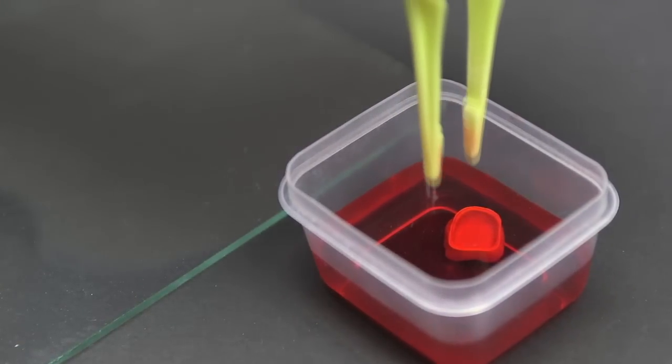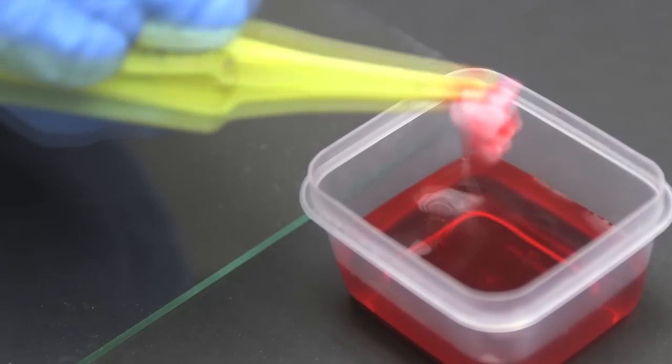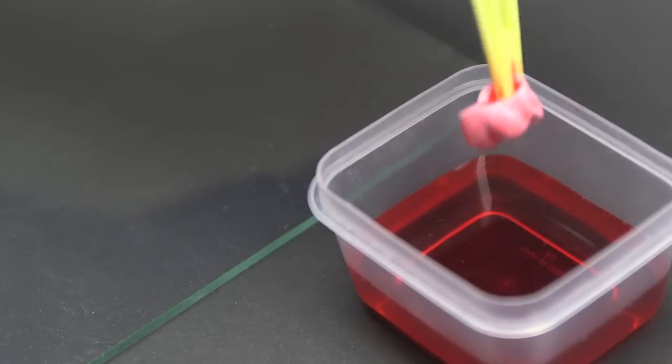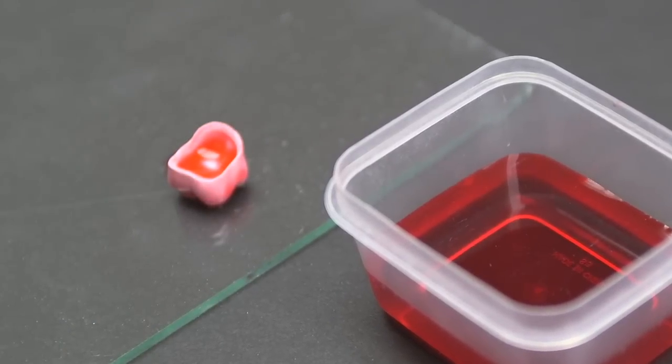After 15 seconds, using the tweezers, remove the crown from the liquid and place it onto a glass plate. A paper towel should not be used as it will absorb the shading liquid from the crown.